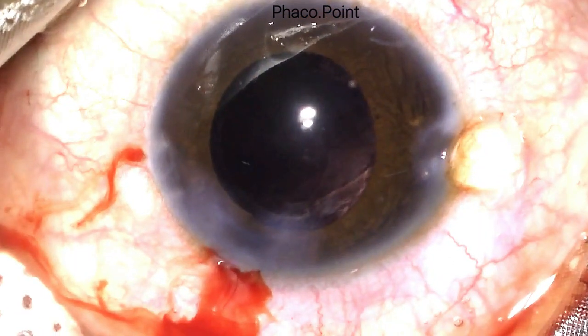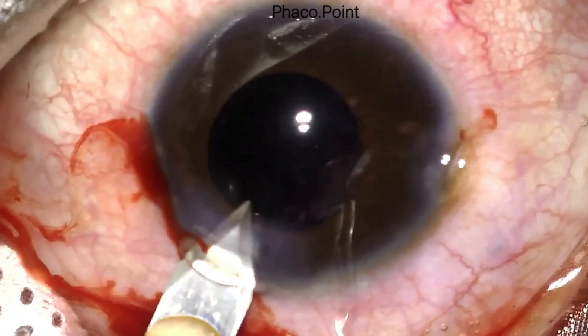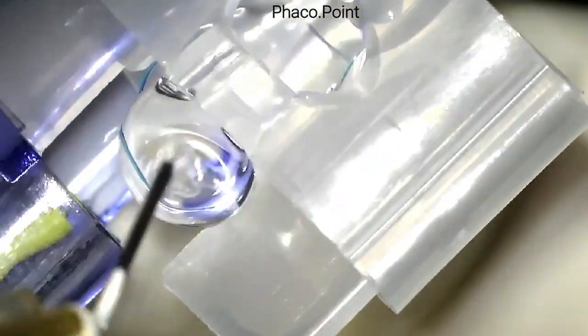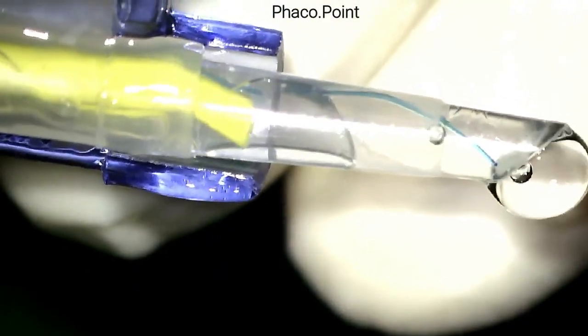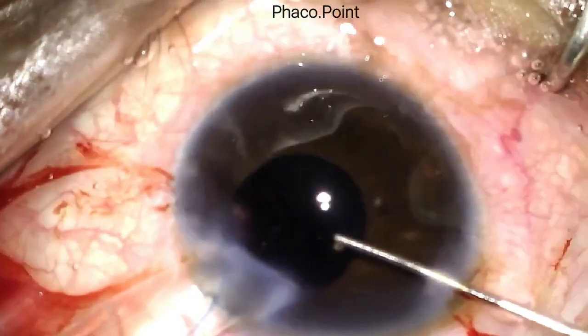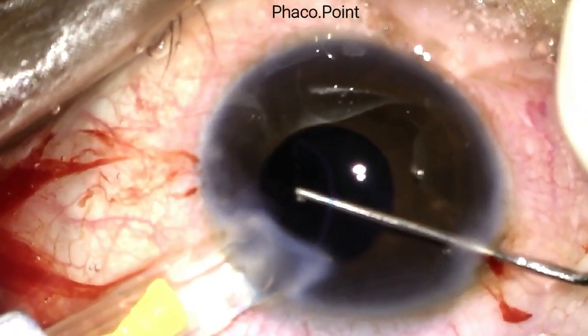In view of the torn anterior capsule, I took the decision to implant a 3-piece IOL. A 3.2 mm keratome is used and the incision is enlarged to approximately 3.6–3.75 mm. We now watch the insertion of the 3-piece IOL. Once loaded, the orientation of the leading haptic is carefully noted as it advances toward the tip, and the second instrument guides the leading haptic into the ciliary sulcus.